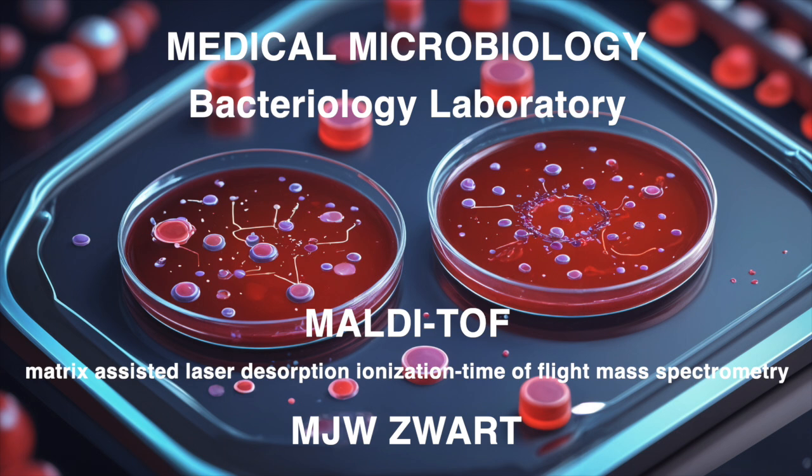Okay, good thinking. Case 4: you have a yeast isolate. What special considerations do we need to keep in mind for yeasts? Yeasts are a bit finicky. They often need formic acid during sample prep. Right, to help release those proteins? Yep. Gotta coax them out sometimes.